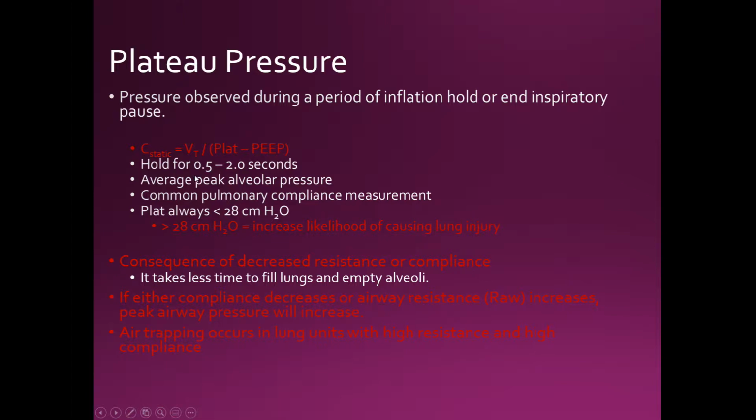Okay, so again, you hold it for 0.5 to 2 seconds. On the Dragers, you have to time it, and you have to hold it for roughly around 3 seconds. The PB840s are great because you really don't have to hold it that long. You just push the button and it will calculate not just your plateau pressure, but it will also calculate your static compliance, which is great. That's something that I wish all ventilators had because we don't have time to calculate. If I start doing my vent checks and I just press the inspiratory hold button and I get my static compliance, I can easily write that and then I can start trending to see if it's going up or going down.